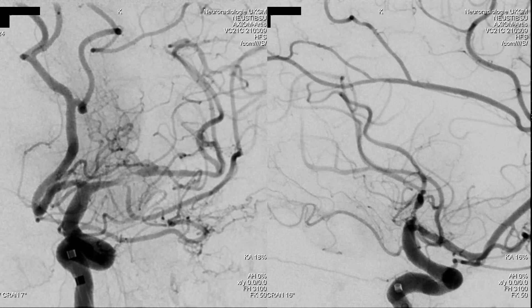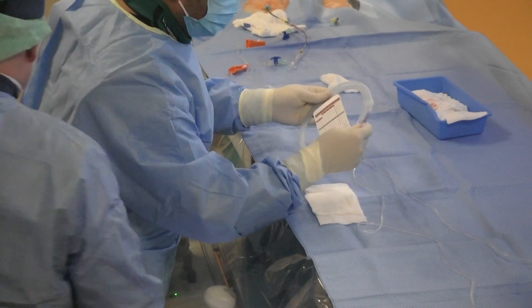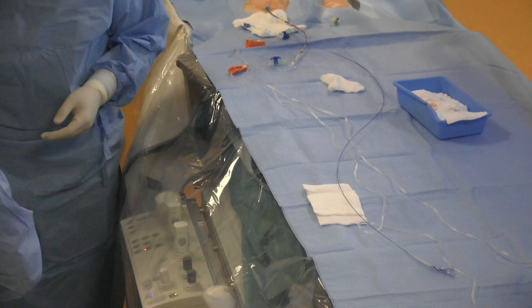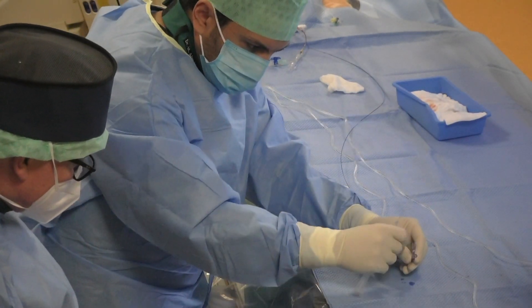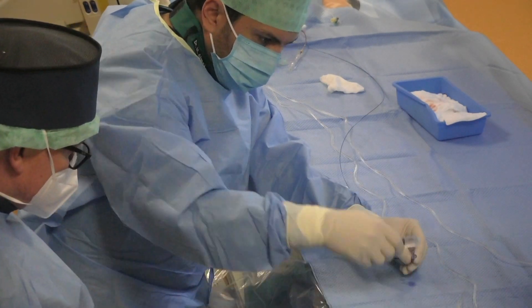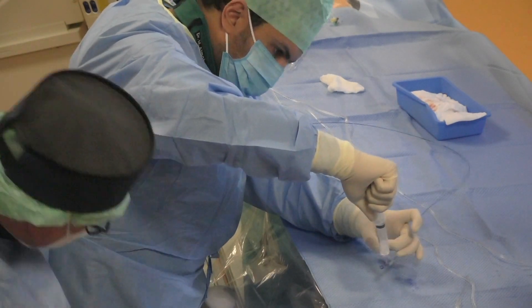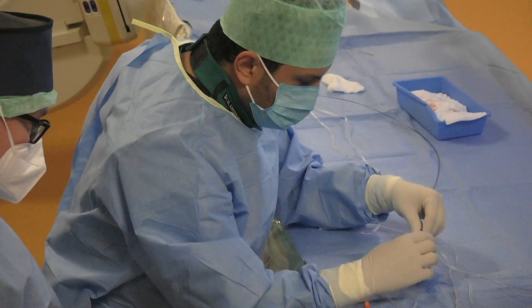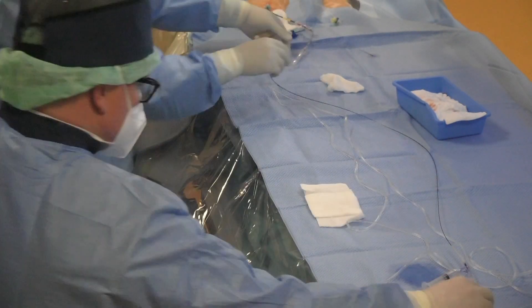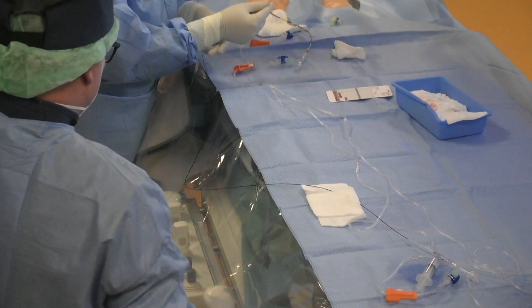We take these images and make an overlay. Here we have the balloon microcatheter Neuro Speed 2 by 8 millimeters. We prepare the balloon by inserting contrast medium into the hub, attaching the syringe, applying negative pressure on the syringe and tapping it with our finger. Then we attach the lumen hub of the balloon to saline and activate the hydrophilic coating by wiping it with a wet gauze.